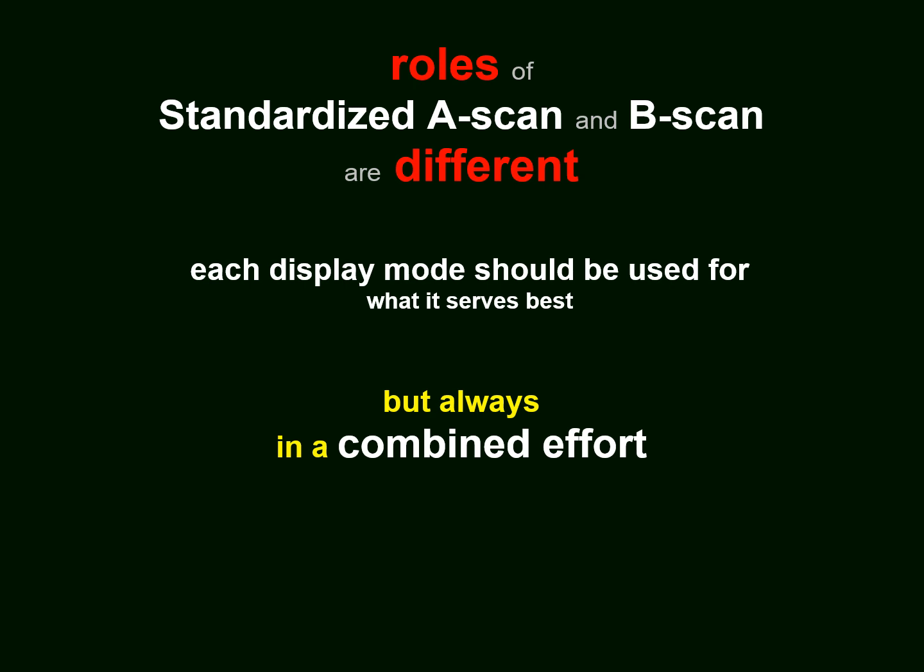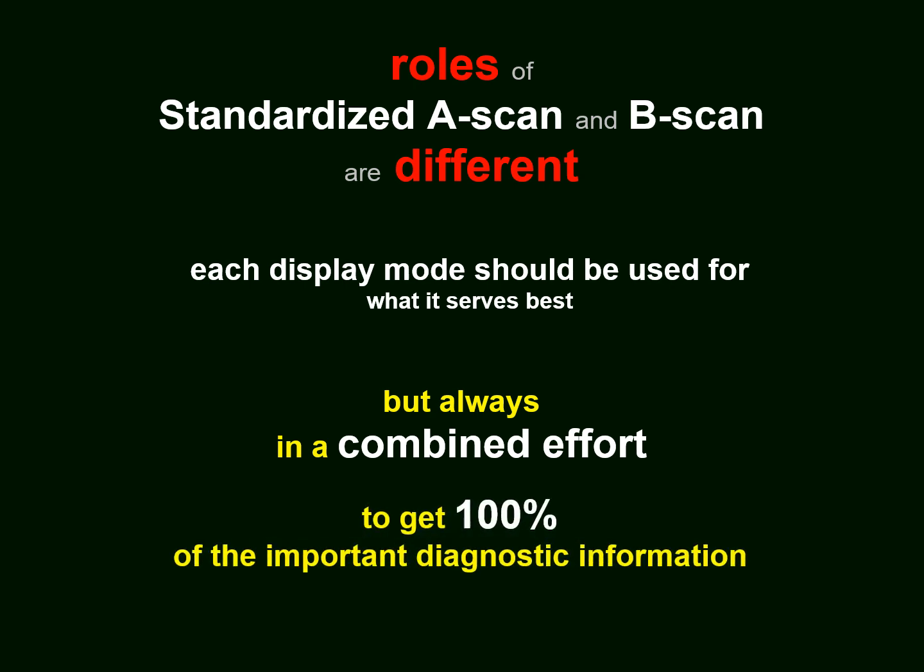The combined effort will provide 100% of the important or needed diagnostic information. Rarely one of the two modalities alone is sufficient to come up with the 100%. Most of the time a combination is required.